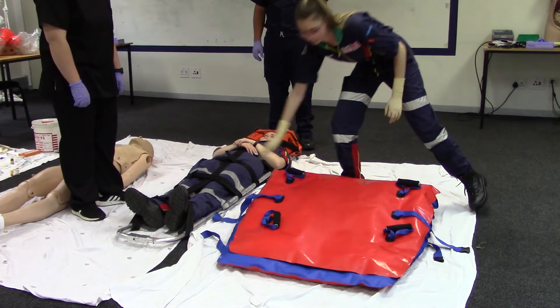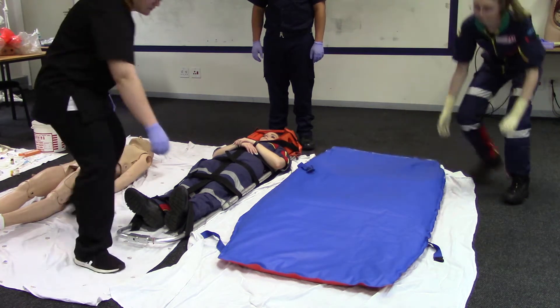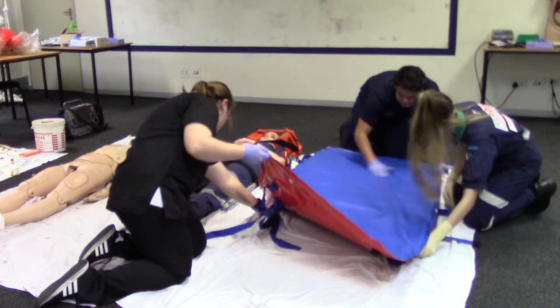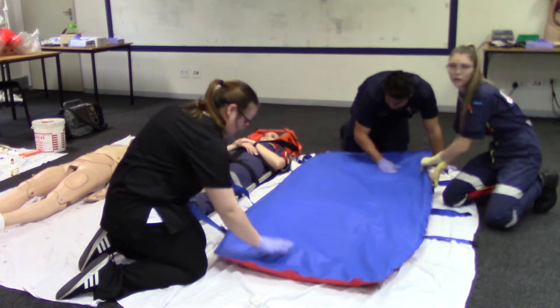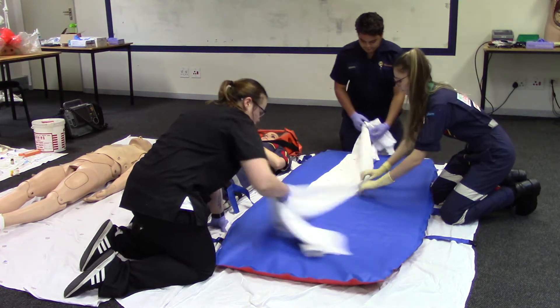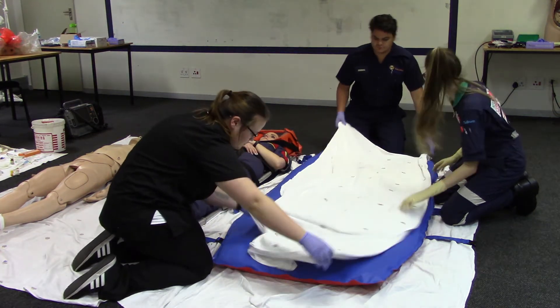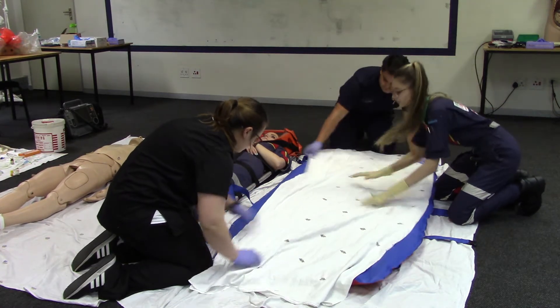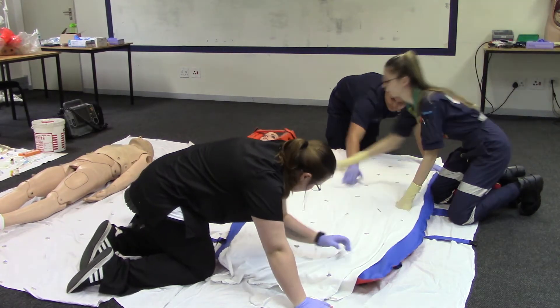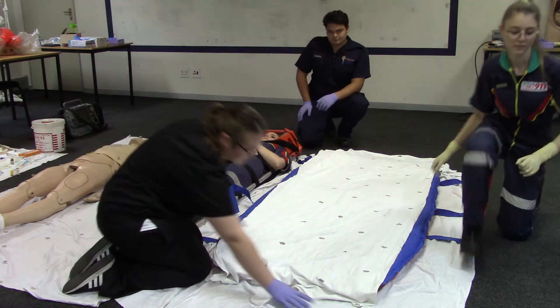Open and flatten the mattress on a flat surface close to the patient. Place a sheet over the vacuum mattress. Make sure that the valve and straps are open and manually smooth the mattress surface out. Connect the manual or automatic pump to the mattress valve connector.